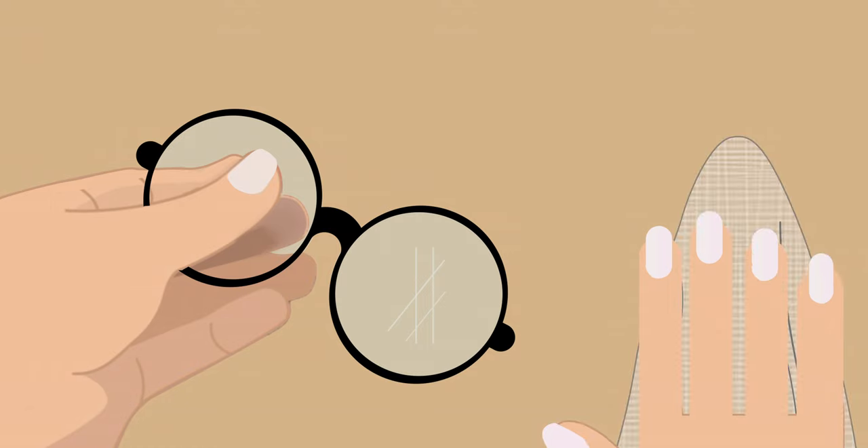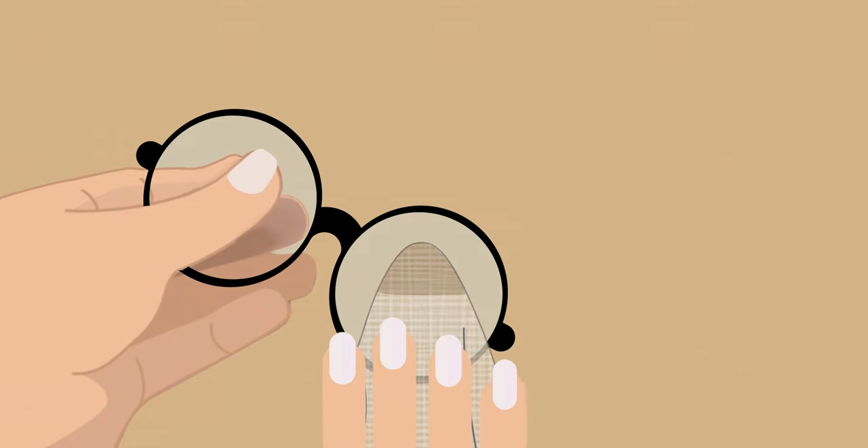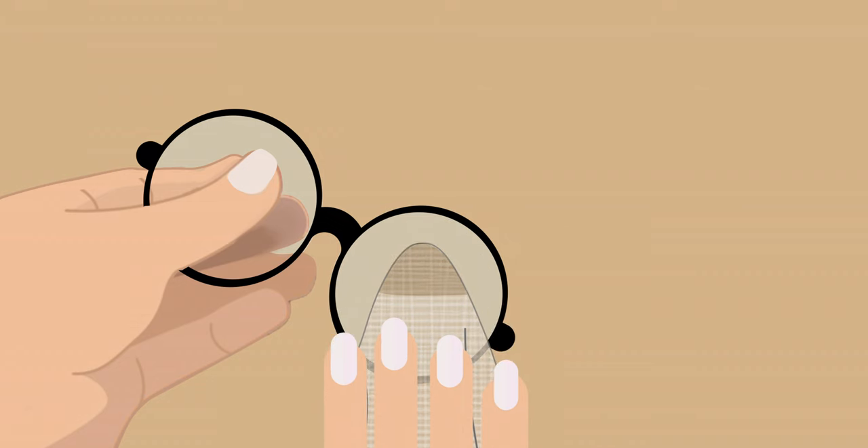First things first, let's assess the damage. If you have minor scratches on your glasses, there are a few simple methods to try. Grab a clean microfiber cloth and apply a small amount of metal polish, just like the kind you use shining up your favorite jewelry. Using gentle pressure, rub the metal polish onto the scratched area in a circular motion. This helps to buff out those annoying scratches. Just remember to be patient and keep buffing until the scratches start to fade away.